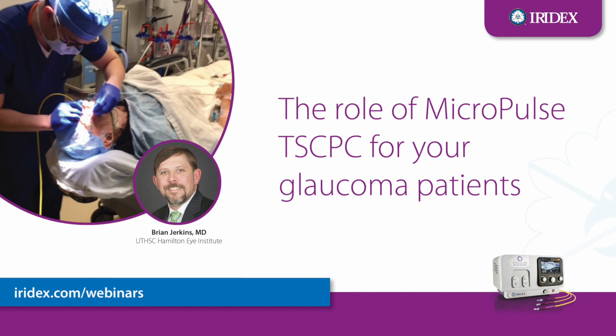I wouldn't say I've seen any major complications. No vitreous hemorrhage, no significant corneal problems other than 1 or 2 dry eye patients that had a persistent dry eye. I've had 1 or 2 patients with some rebound iritis that has taken a little bit of time to clear, but other than that, no other significant complications. If there has been a progression on a cataract, I have not really appreciated it, and I don't think it's been significant if it has. But otherwise, no posterior complications whatsoever. Like I mentioned earlier, I've not had a problem with any significant CME long term. So it's been relatively complication free.